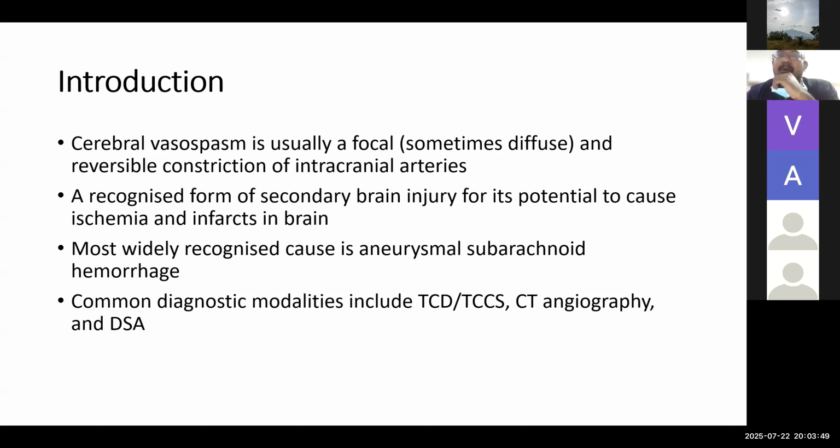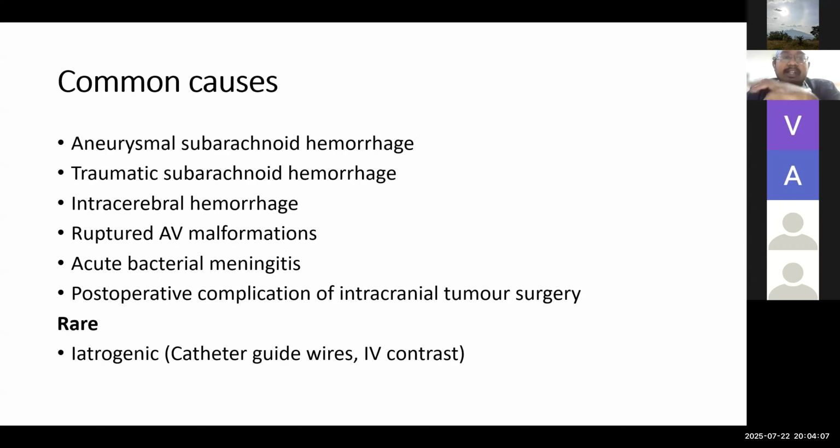Now, to spot it, we have TCD. TCD is a common bedside radiological modality which we do at the bedside. And as I told, the common causes of vasospasm are based on that.